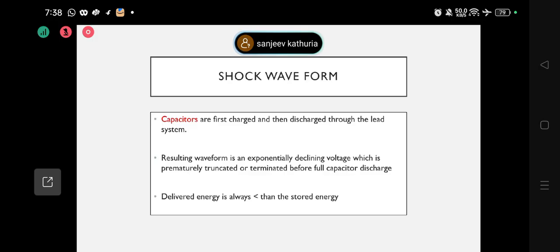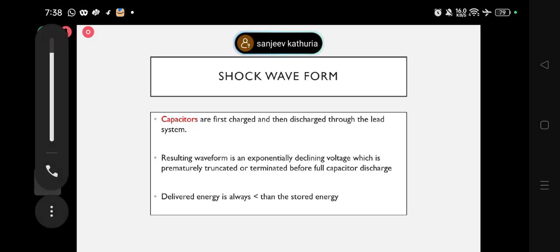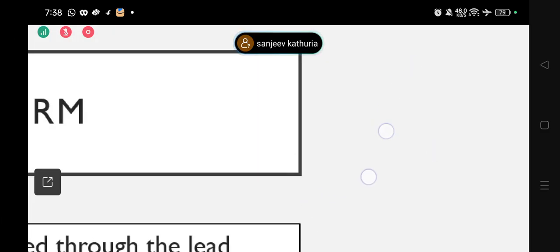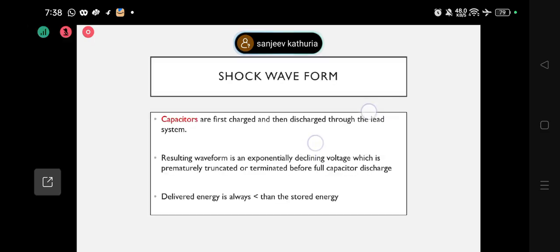The capacitor is the one which takes time in the VT window to do something, not to give a shock. Capacitors are the real life of the ICD. That is why when somebody has a lot of ATPs, the capacitor is draining, because it will be charging while it is giving ATP. It will say, if the ATP fails, the patient will die, so it will keep charging. ATP will prevent only pain to the patient, but the capacitors will still be used. Beautifully explained.